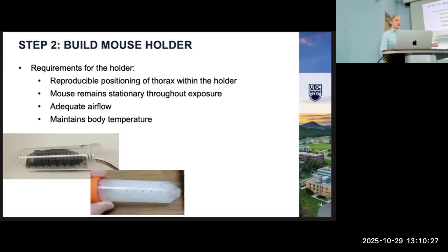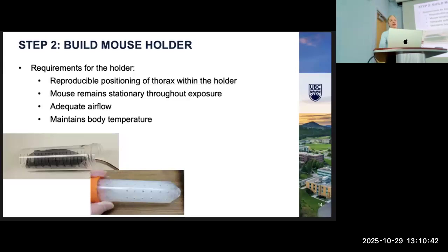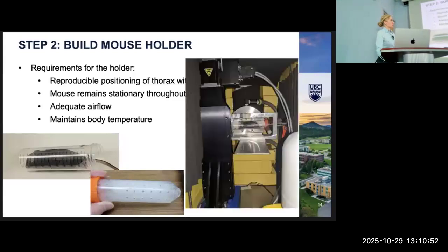Our first attempt was to just drill holes in it to get some air in there. But then we couldn't see the mouse, which we thought might be a problem, because mice under anesthesia eventually will wake up. In this scenario, they have to have injectable anesthesia, so they're down for about the time you think, plus or minus a margin of error. We didn't want a mouse waking up partway through irradiation, so we needed to be able to see it with video.